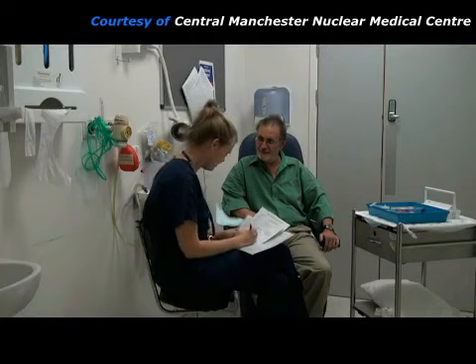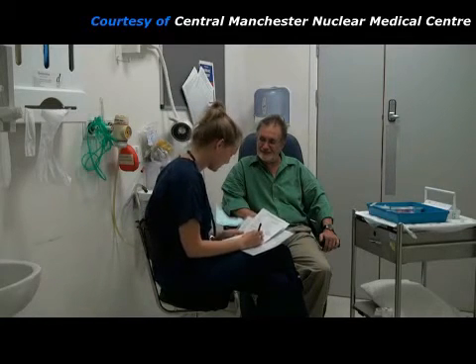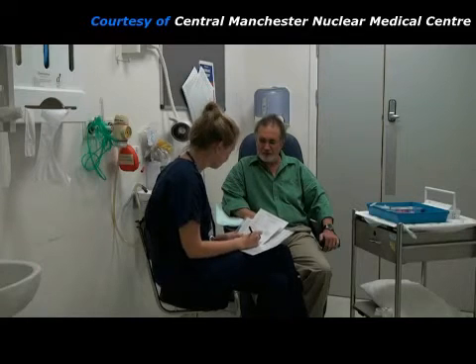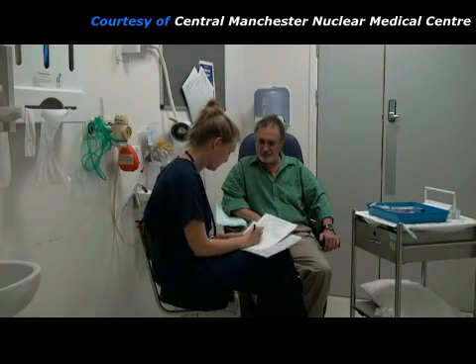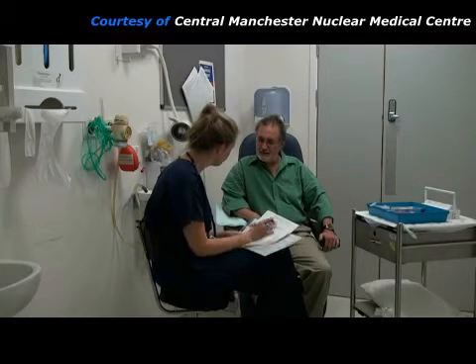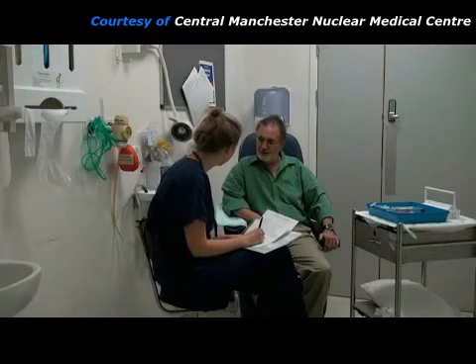The practitioner checks the patient's identification to make sure that she has the correct person. She asks the patient about his symptoms, explains what will happen during the test, and answers any questions that he may have about it.